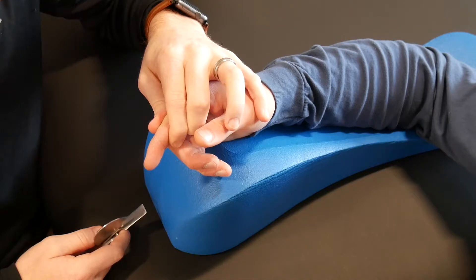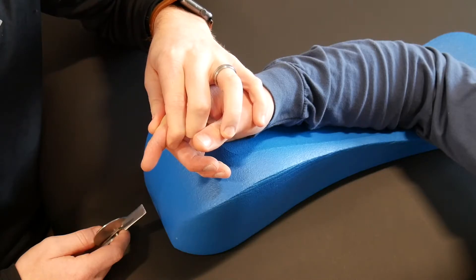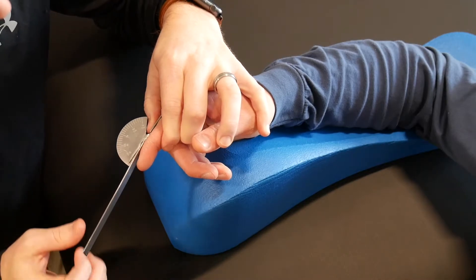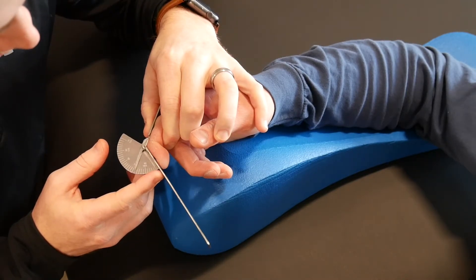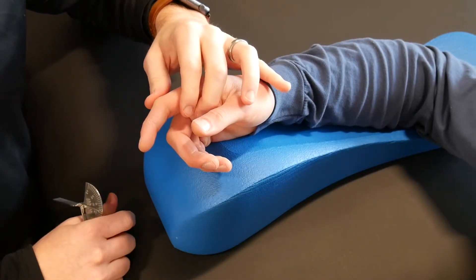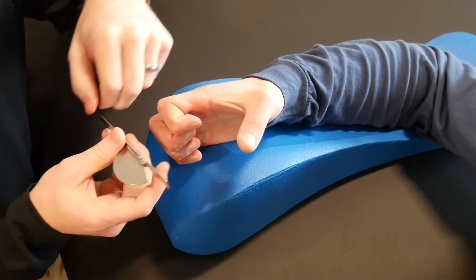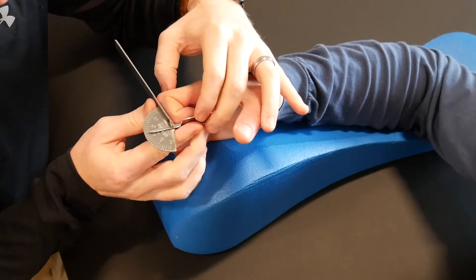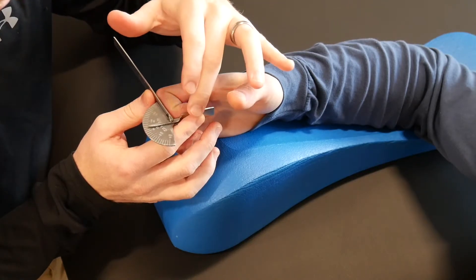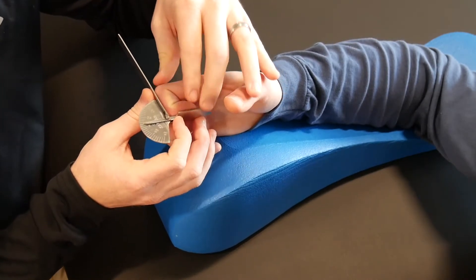For DIP flexion, you can take this a few different ways. You can take an isolated DIP flexion measurement by immobilizing the PIP joint and having them bend — that gives you an isolated DIP joint flexion measurement. Alternatively, you can have them make the best hook fist they can and measure the DIP joint that way. He's got about 75 to 77 degrees there. For passive, you're just going to take it as far as they can comfortably tolerate.